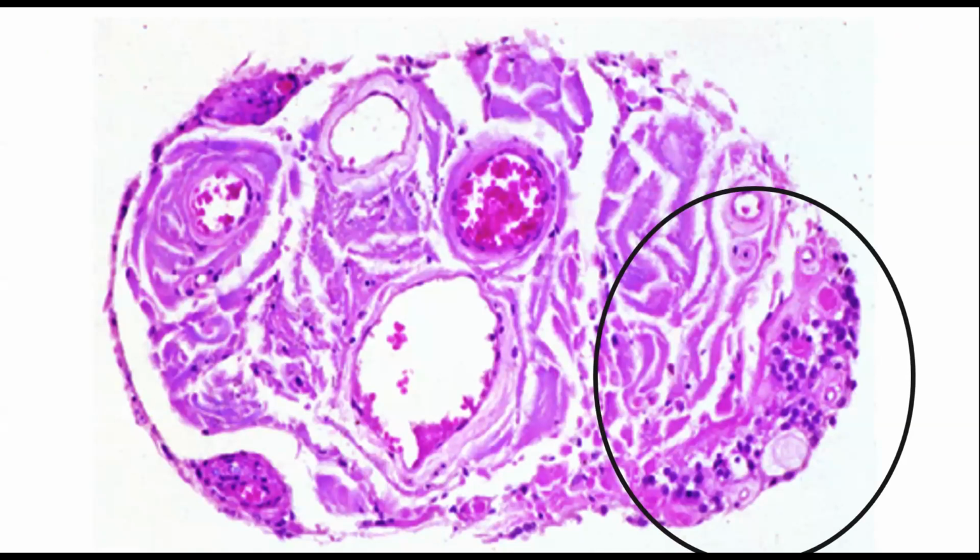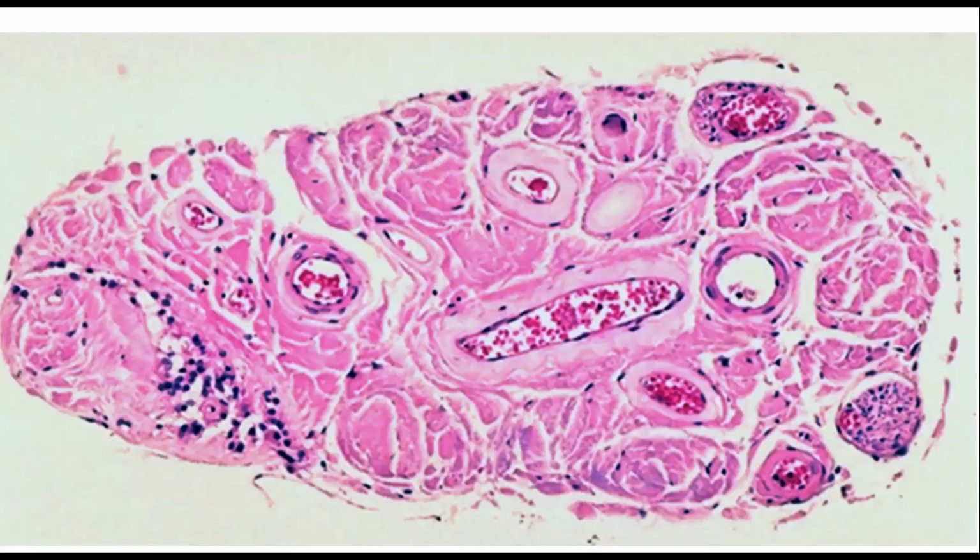By the way, you can also see from this that the filum terminale is 90% collagen. And then you can see a large artery and a couple of veins. Those will be the spinal arteries and the vein, a big blue vein. Neurosurgeons can recognize that intraoperatively. This is a second example, a cross-section of normal human filum terminale internum, collagen, the big vein.